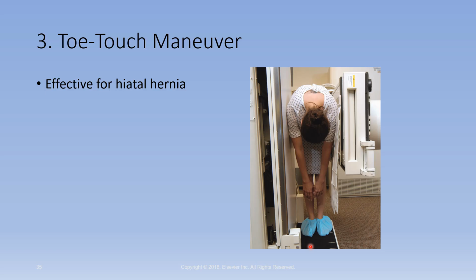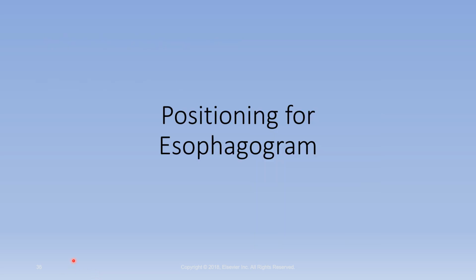And then we have them stand up there. Initially, they're erect in an LPO position, but this toe touch maneuver demonstrates a hiatal hernia. Okay, now we have positioning for an esophagogram.